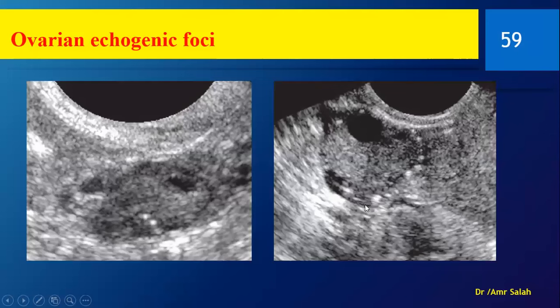Menopausal, when I see the corpus luteum, many corpus luteum, we've said that it forms the corpus albicans, okay, they form the corpus albicans here. So in menopausal or perimenopausal or postmenopausal, the ovary, of course, starts to shrink in size, and I see many, many corpus albicans. The previous cycles, they were corpus luteum, but then start to fibrose and shrink in size, and they form these corpus albicans as such.